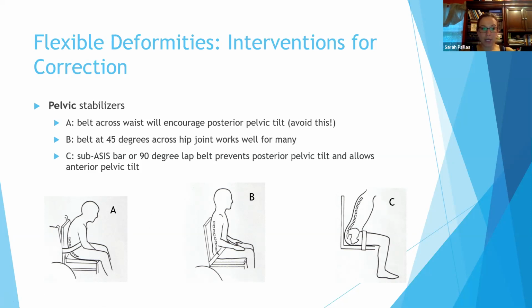And what happens, as you can see in this picture, is the individual is slumped over in a very kyphotic position. And obviously that's unsafe, right? A lot of times these are the people that sort of, quote unquote, fall asleep in their lap and obviously could fall forward in their chair.